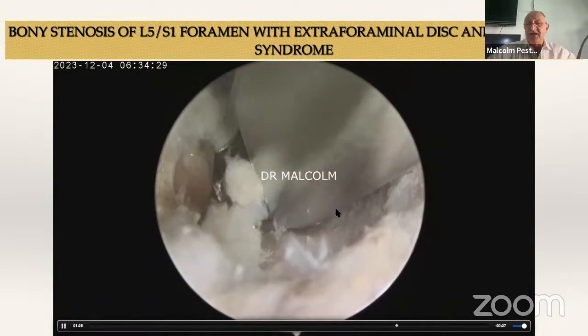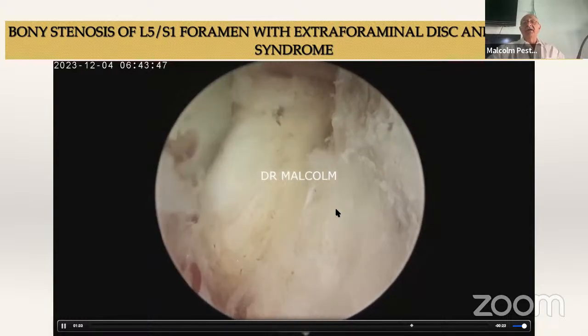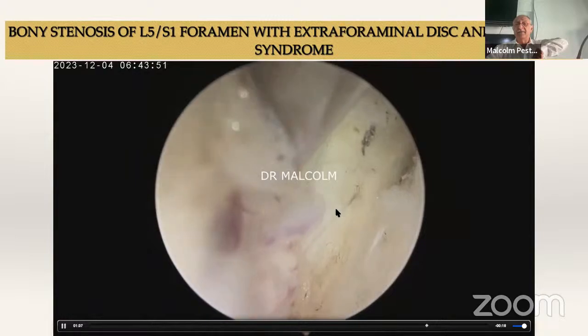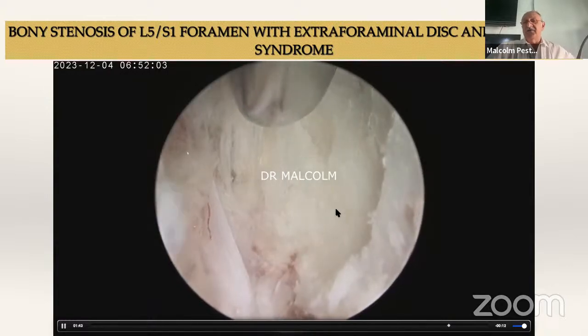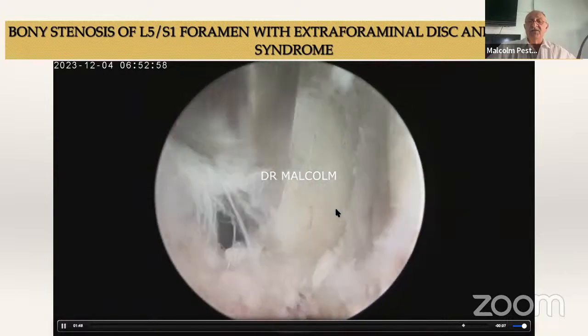I have a herniation there to attend to, and I have a Bertolotti's to release. So here I'm pulling the root cranially. I've come from by the side of the sacral side. Now I'll be perforating here to remove the fragment. So first, initially, I don't get the fragment, but slowly the whole fragment gets mobilized, and we have a huge fragment coming out.